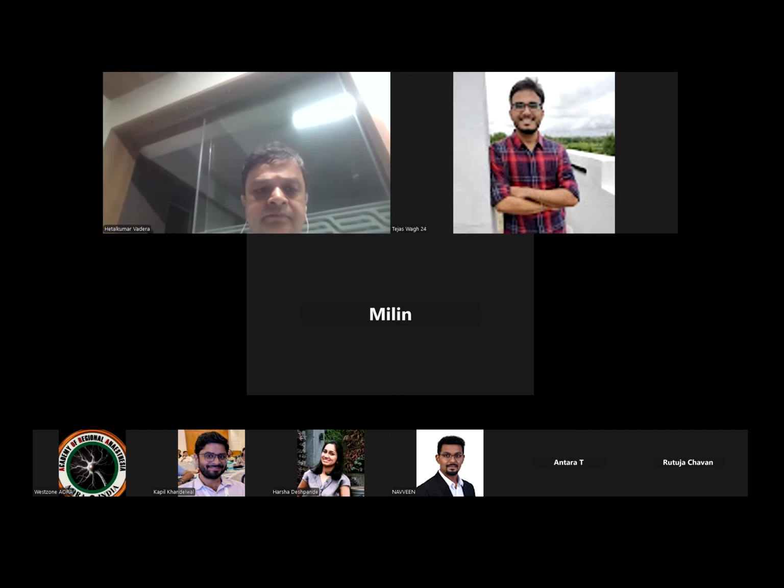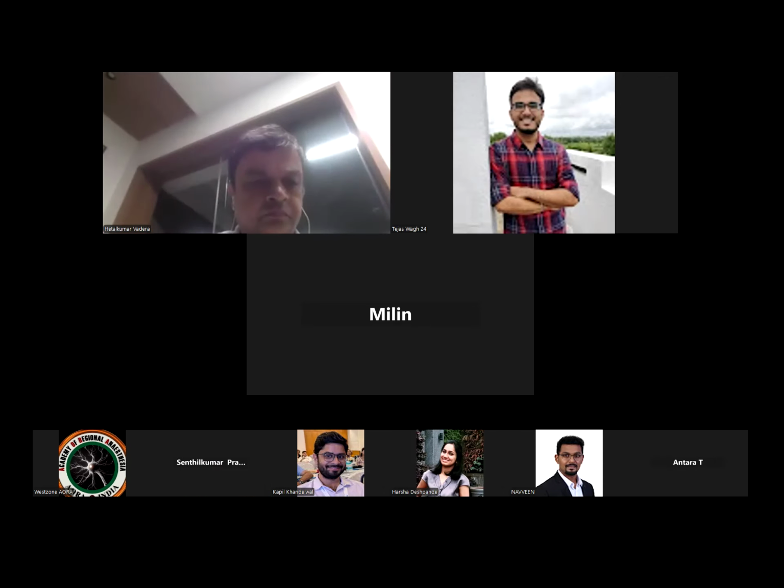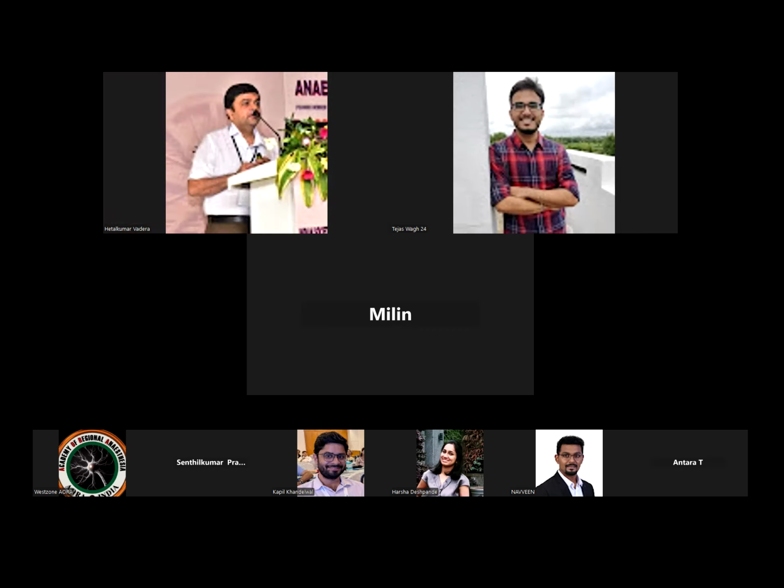Yeah, please. So while performing a lumbar plexus block with the help of USG, the psoas muscle has many intramuscular tendons, which also look hyperechoic and can be confused with the lumbar plexus. So it's important to use the PNS and get the desired quadriceps response, because when you are around the intramuscular tendons, you might confuse them with the lumbar plexus and deposit the drug there, and you'll get no response. That's how we will confirm that it's the intramuscular tendon and not the lumbar plexus.